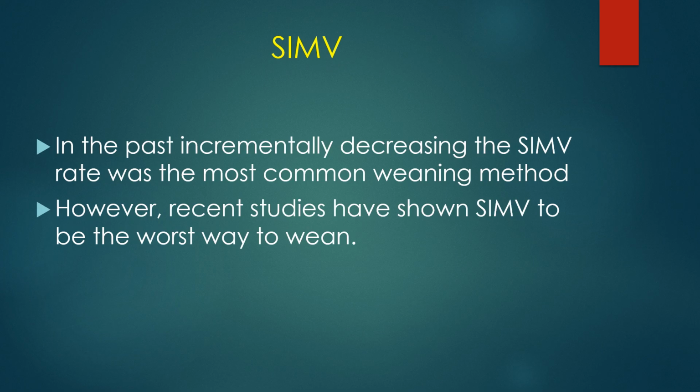Now, they gave us SIMV a long time ago, telling us that this is the best way to wean your patient off the ventilator. Because remember, back in the olden days, we pretty much had 2 modes, on and off. The patient's on the ventilator or he's not on the ventilator. And so we have a patient that has been on the ventilator for a while, and his x-ray's starting to improve, and he looks better. And so we take him off the ventilator and see if he can breathe, right?